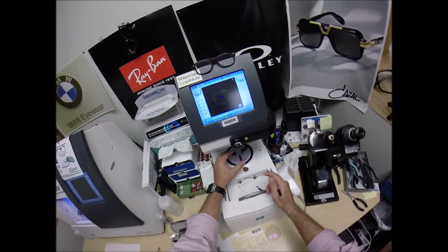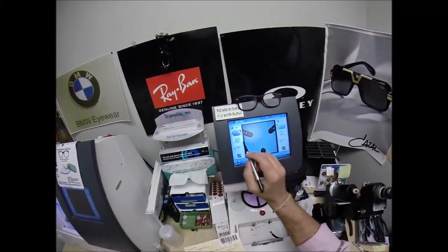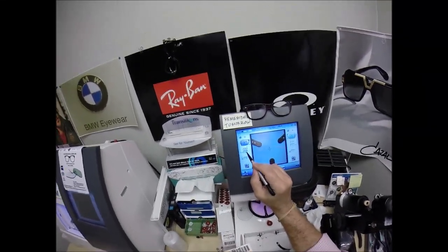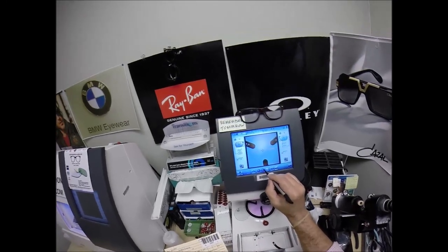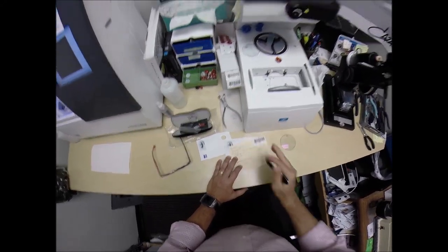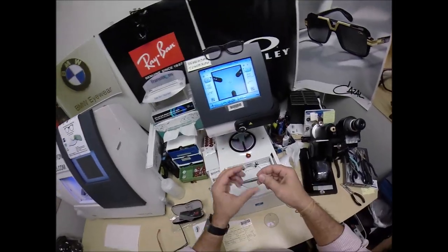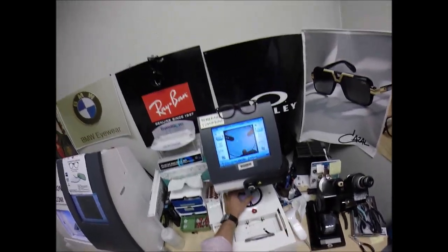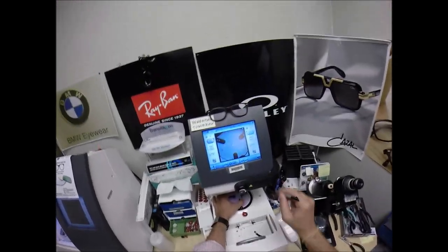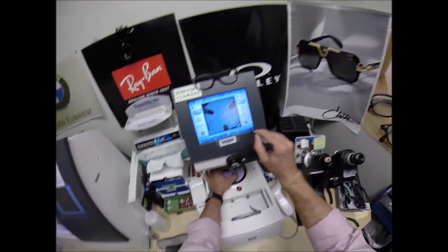I need to enter the pupillary distance on the screen. His PD is 65 divided by 2, which is 32.5, so that's where the computer starts. I'm going to go up to 21 millimeters — we're going to go 2 above center and cut it at 21 high. Now just the one black dot. I'm going to rotate it until it lines up. Hit that button.